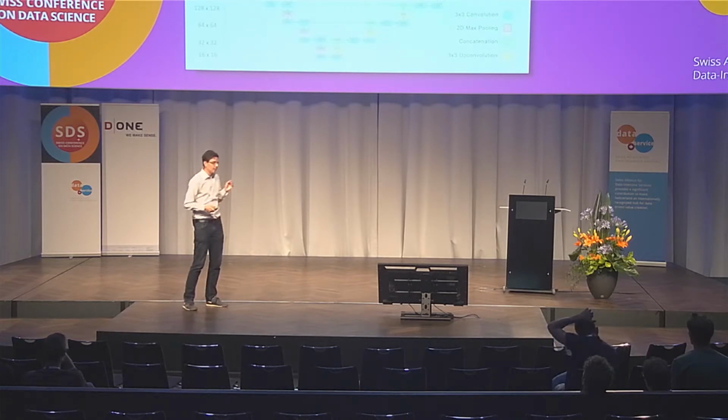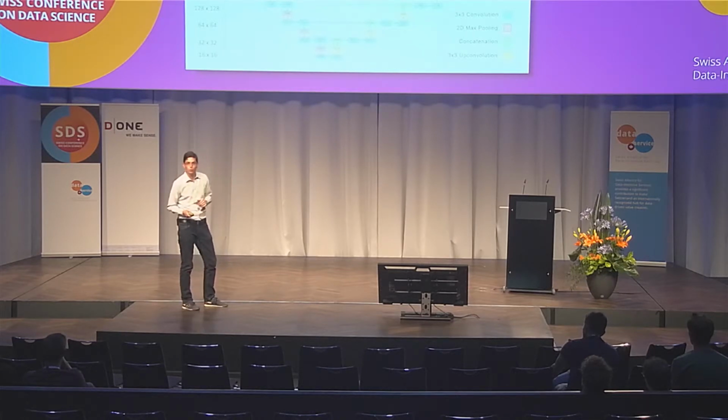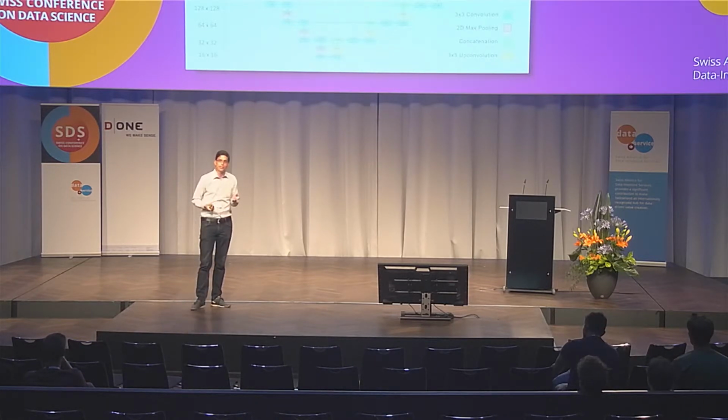And we didn't take the original UNet, we had to make some modifications to it. Most importantly, we had to add one more layer in depth. This is indicated by this step here, and we did that to increase the receptive field of the net. That was necessary for us to get better predictions.